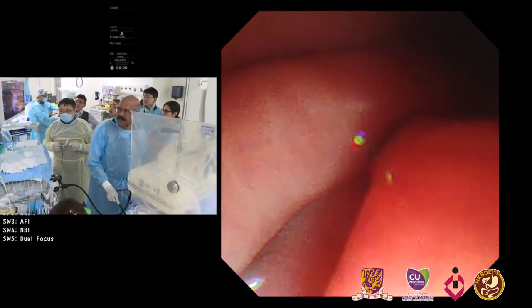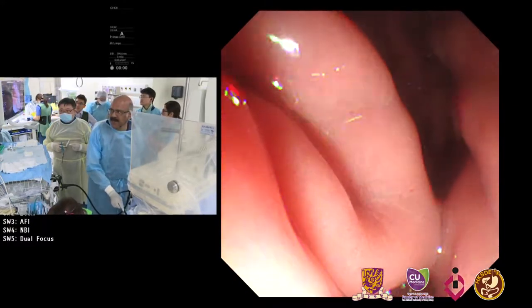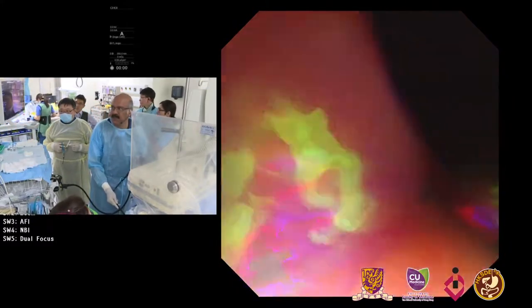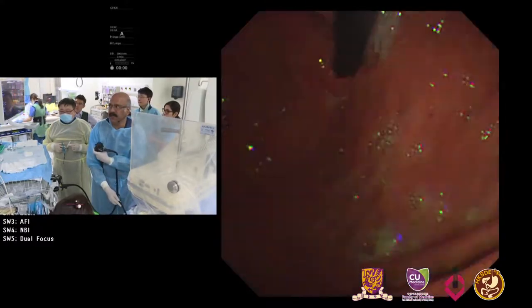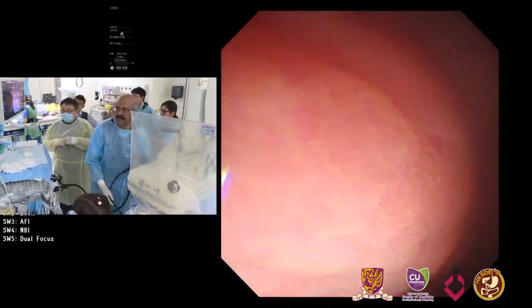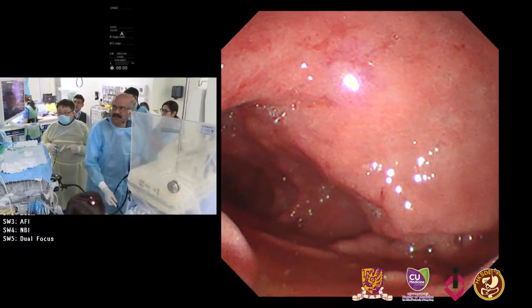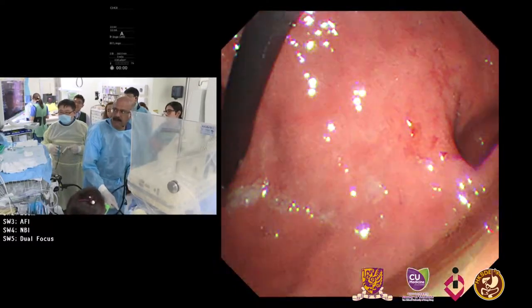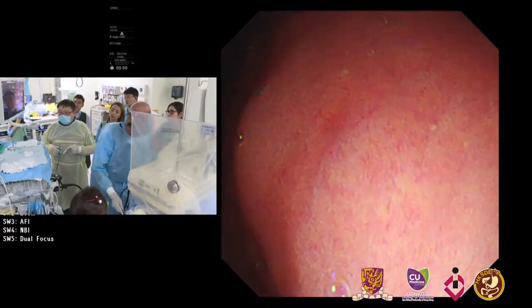Now, sometimes when the patient is very thin and lying totally prone on the stomach, separating the antrum can sometimes be difficult. So the scope tends to actually loop. So I'm pulling back, turning slightly to the right to see if I can find it. Now you can see it's retroverted there, so come back, and this time I'm just going to go down towards the pylorus, and this stomach is cascading a little, so I have to go to the left now so that I don't loop too much in the stomach, and then go towards the pylorus.